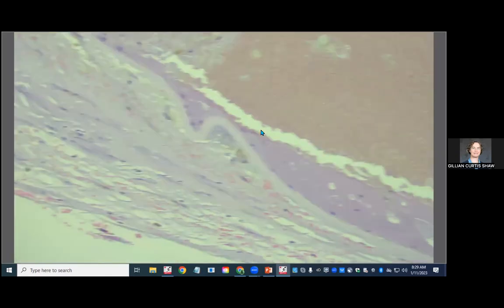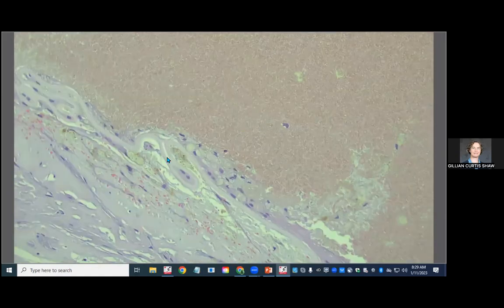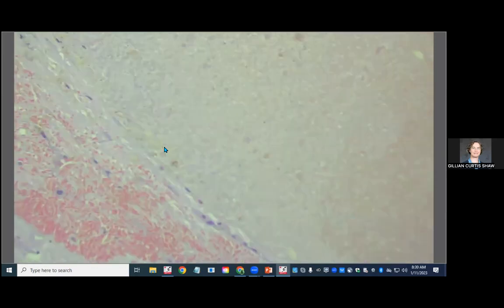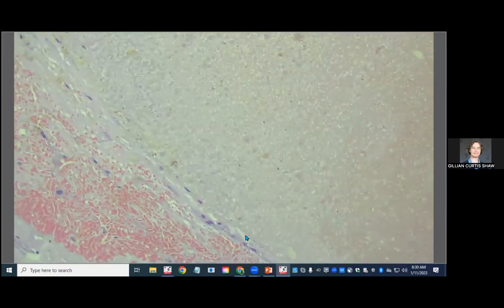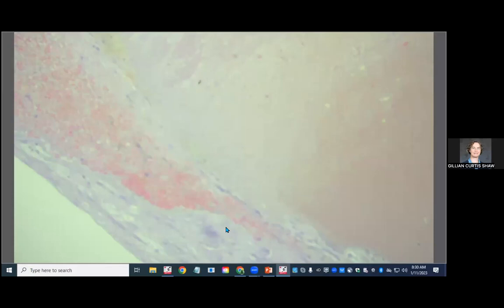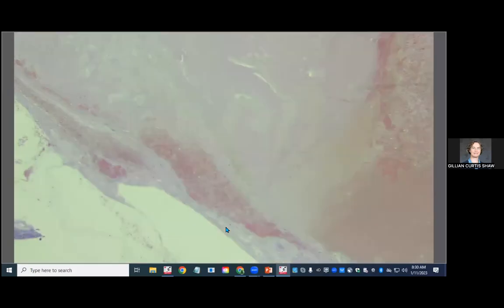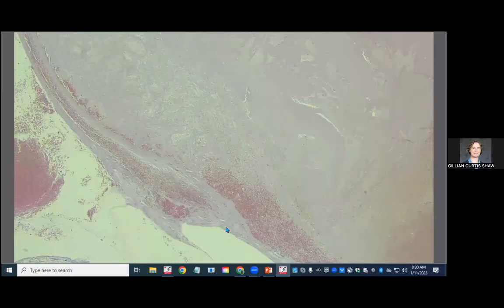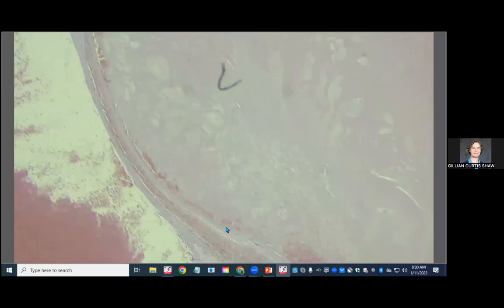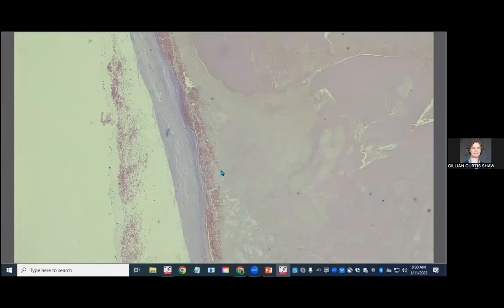And you can see that it's very wrinkled. And as we track it along, here's more wrinkling. It's folded on itself. And then eventually it just sort of ends. Maybe right back here somewhere. And then the entire back of the lens represents this big defect where there isn't a recognizable capsule. And instead, this area is bridged by this very thick postlenticular membrane, sort of fibrovascular to fibrous membrane back here, all of this stuff from here to here.